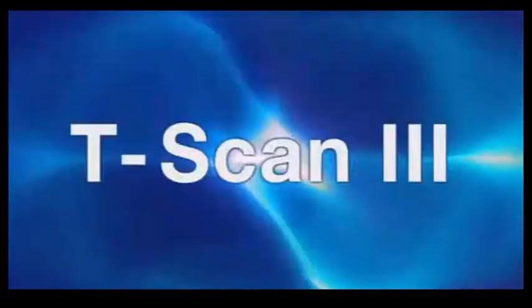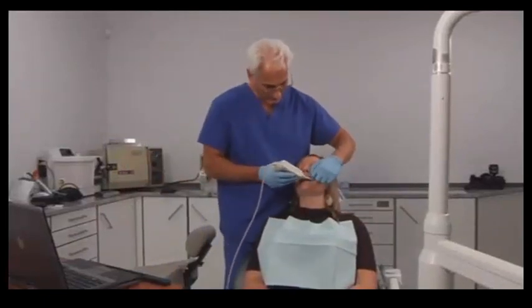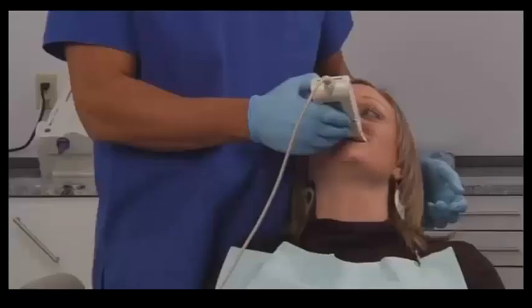Okay. I'm going to have you bite down on the sensor again, but I just want to make sure that we have a good recording level for you again. You've been away for a week, so just close firmly and open for me, and close firmly again, and good, open, bite down again. Now slide to the right, and good.